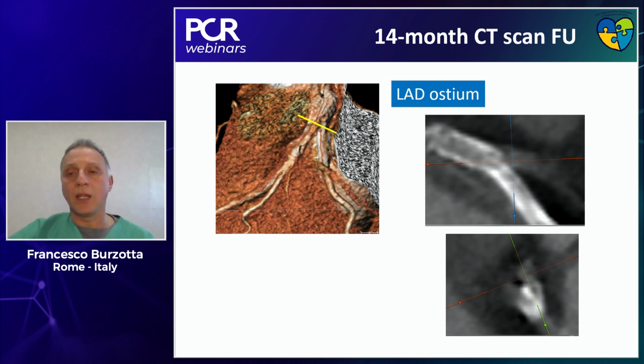So this is the case I want to share. And I think that this is really rare to apply to the circumflex, but basically we did all we do routinely for the LAD ostium.